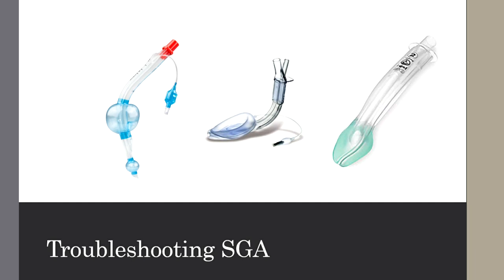Even with proper placement of a supraglottic device, we can sometimes come across issues that we'll need to troubleshoot. Remember, this isn't a device where you just place it and ignore it. You need to constantly monitor this device and ensure that it's effective.